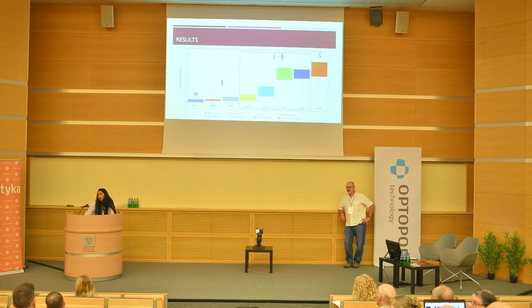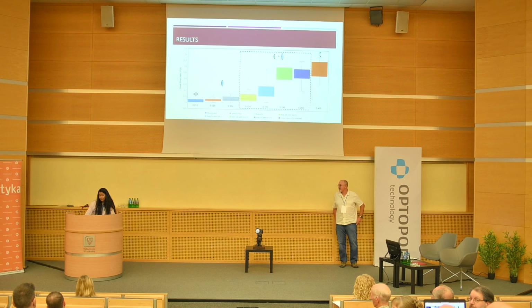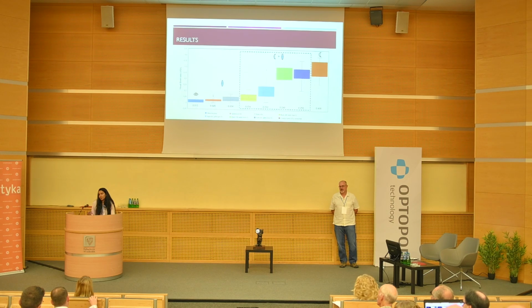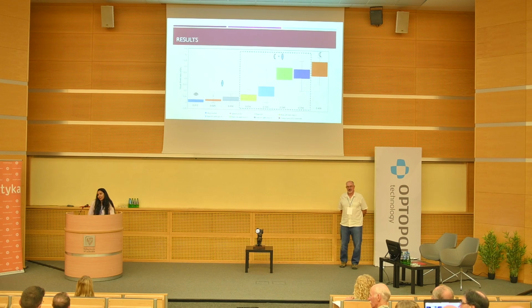Well, with the IOL, it's a monofocal IOL, and what I felt when I was doing all these operations with an IOL, there's a little bit of spherical aberration coming, and even with the toric IOL there are some aberrations that were not there when there's just the lens. So one thing with the IOL, at least the monofocal IOL, it happens.